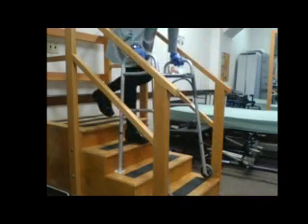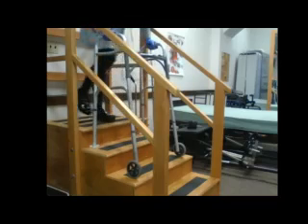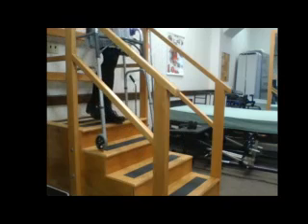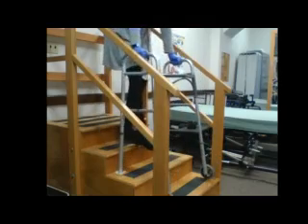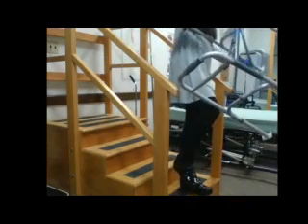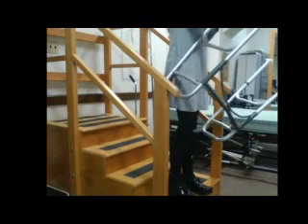A standard walker without wheels is really good for this compared to a rolling walker. And then once they get to the top, again, they would have to hold on, have somebody move the walker wheels, or have a separate walker here. In order to go down, you would want the walker to be lower. Get to the bottom step. So it can come in handy, but it only works in certain circumstances.